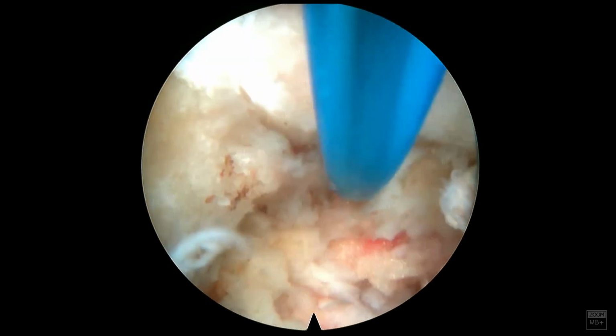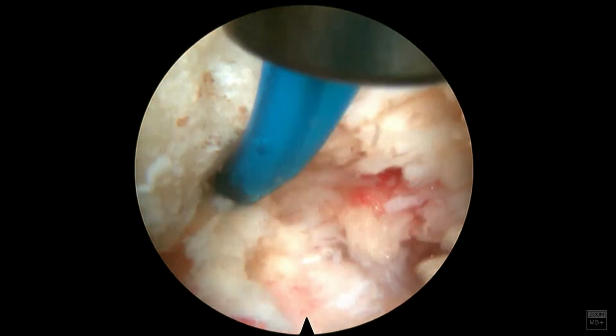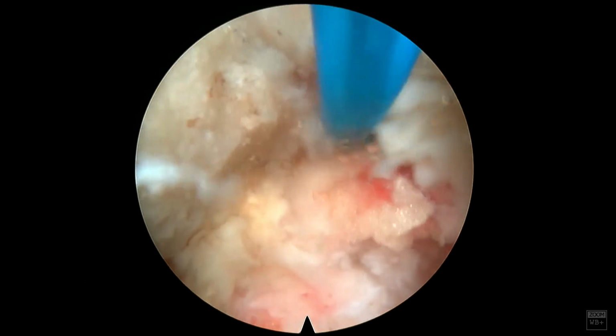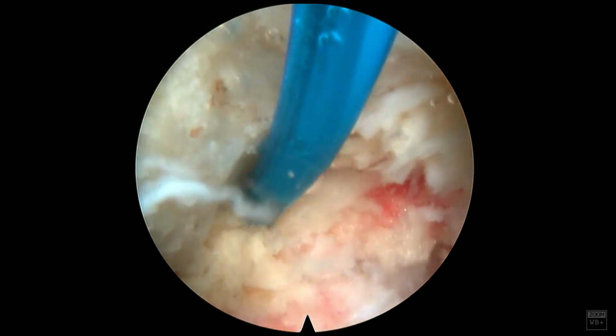So here I'm looking at the joint, seeing it move, making sure I can visualize where I'm at on my head. There's still a little bit of ligamentum attachment. I'm not too apt to get this. I'm trying to remove it with the vape setting on the RF probe.